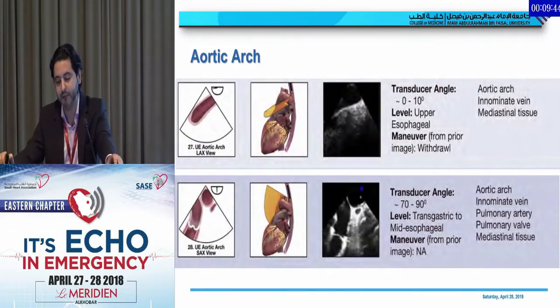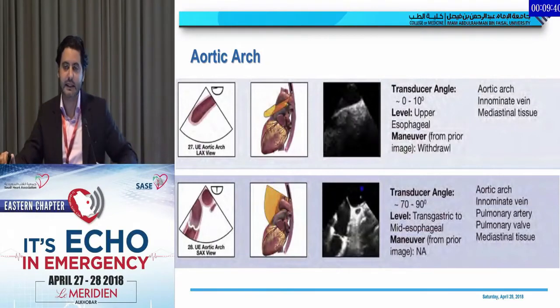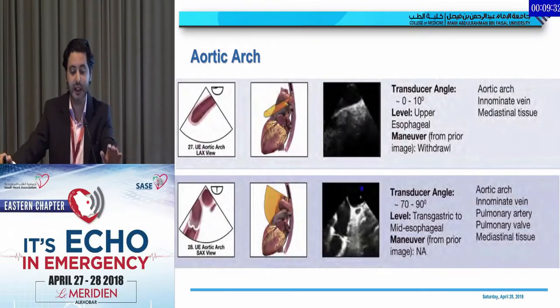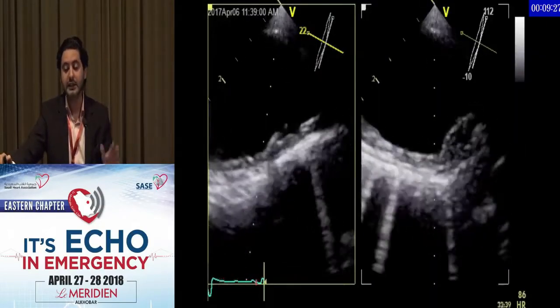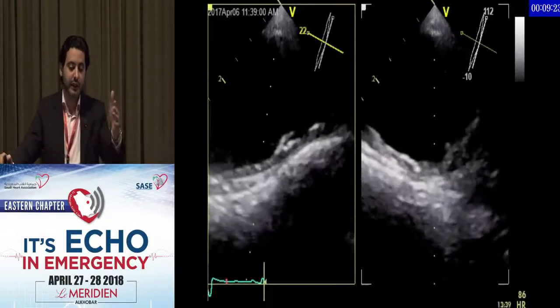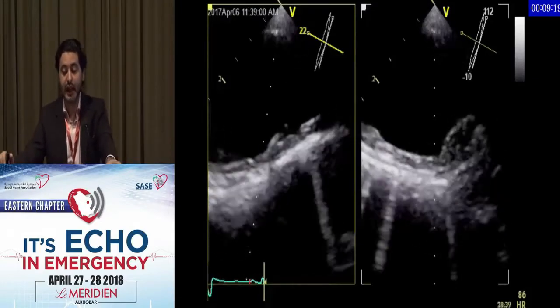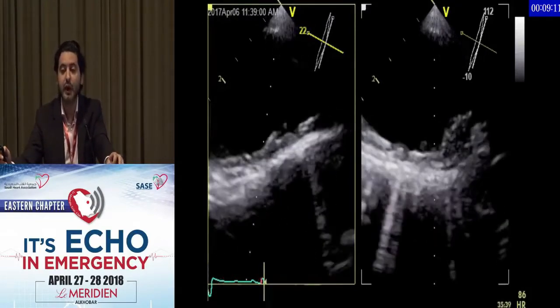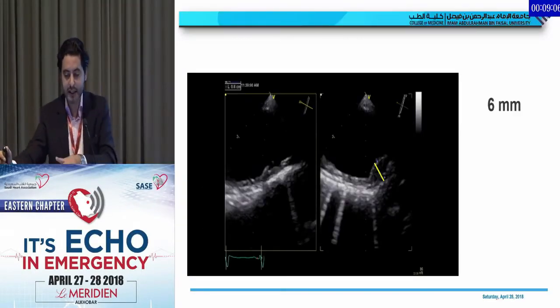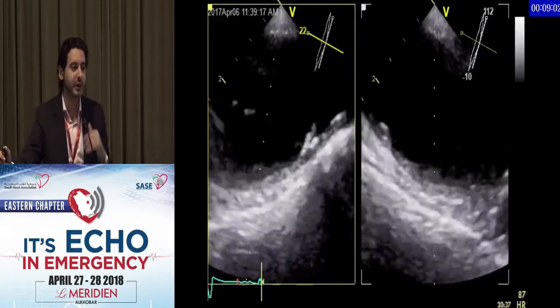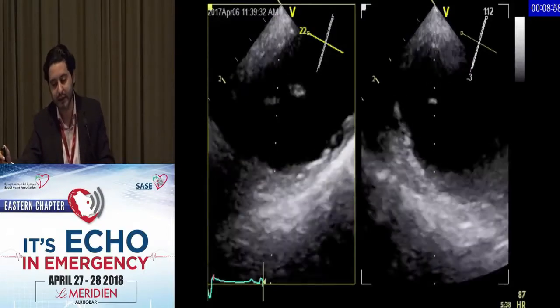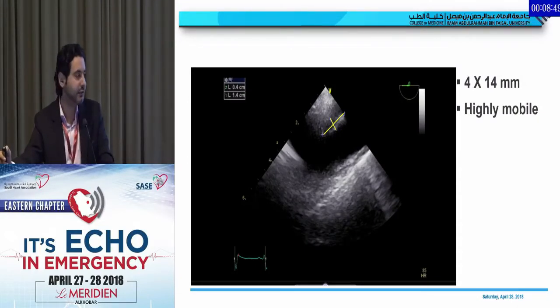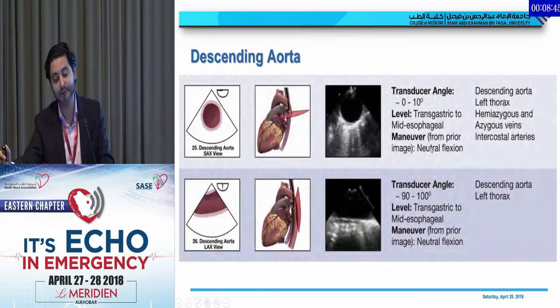The aortic arch is very tricky. We do it after finishing the descending aorta as we go up, then rotate to the right side. The long axis is at zero degrees and short axis is at 90 — opposite from other segments. Here you can see an atheroma that is ulcerated with a mobile element, so it's complex, measuring six millimeters. After rotation, we see a mass coming toward us — a thrombus attached to the wall of the aortic arch measuring four by 14 millimeters, highly mobile. The patient has to go to the OR to have it removed.